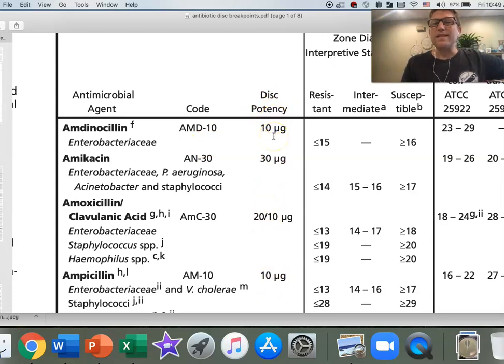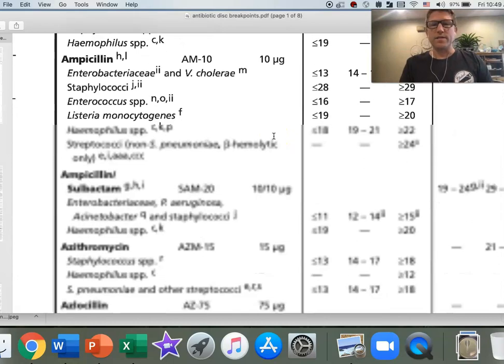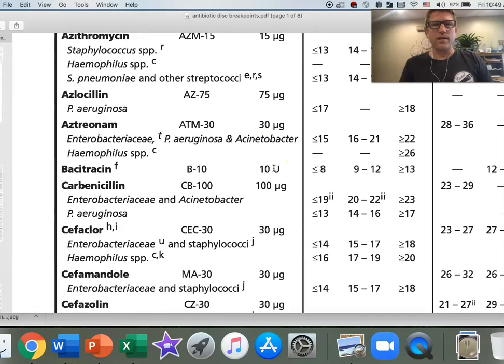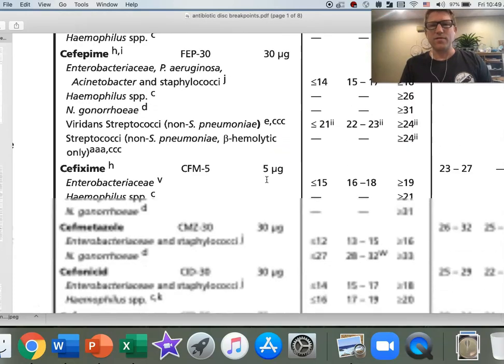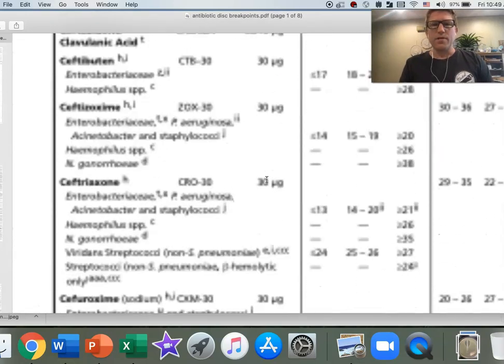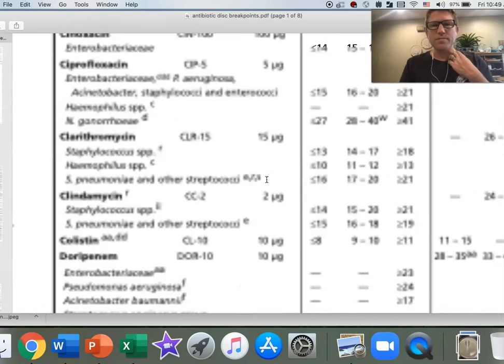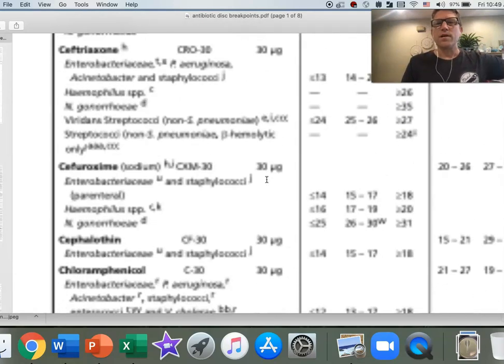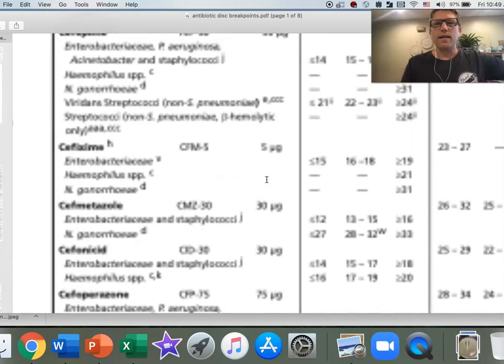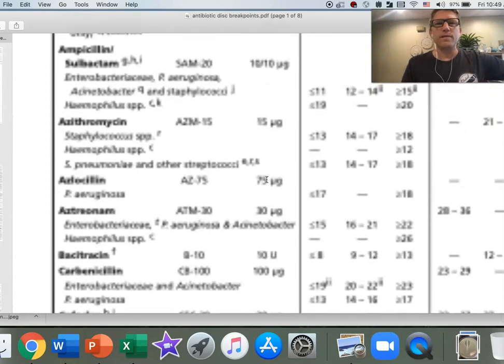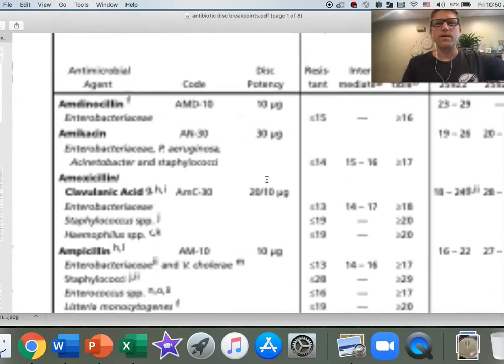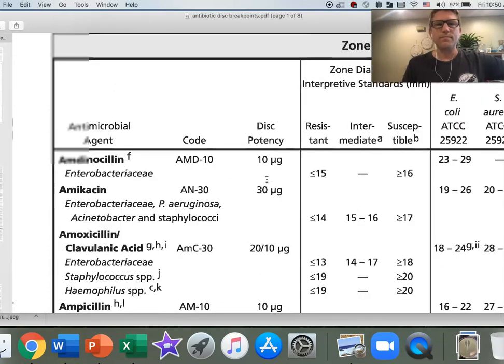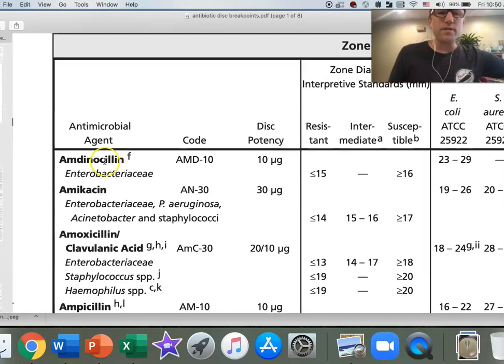It tells you how much antibiotic, what mass of antibiotic they put in the discs. That's important because in some cases, you can get two different kinds. There's usually a standard mass that they put in one of these, but sometimes there's a couple different options depending on the bacteria that you're analyzing. Let me scroll back up to the top so we can see the titles of our columns.